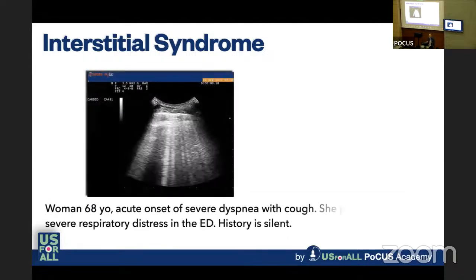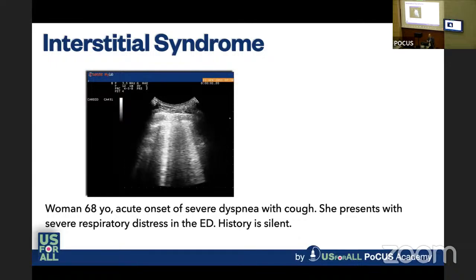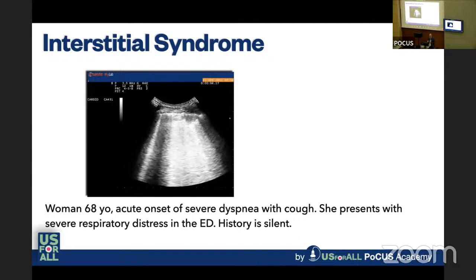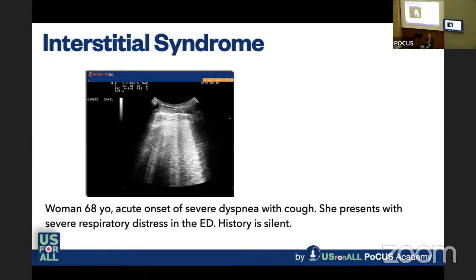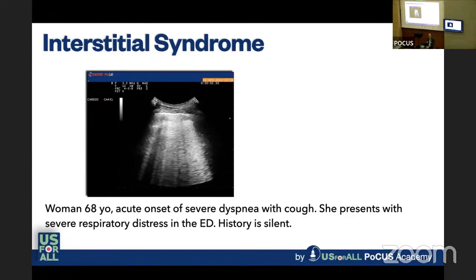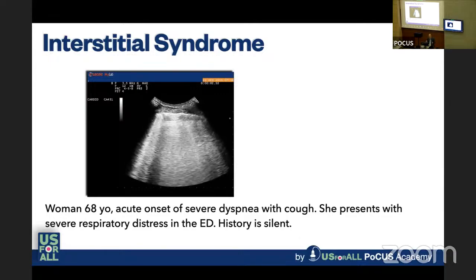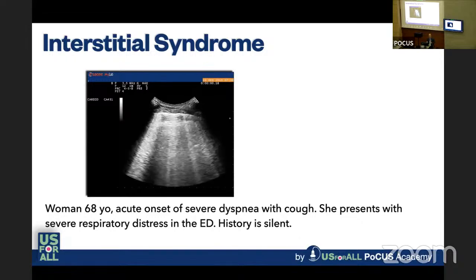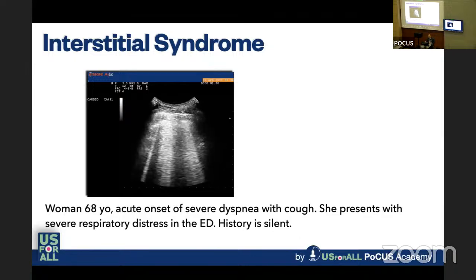For brevity, we only talk about the principles. In the afternoon, we will do hands-on together, and I will show you the technique, how to obtain the correct examination of the lung. Another important point for you to understand is that B-lines are the sign of a condition of the lung. That is, as I told you, partial loss of aeration. But they are not a sign of a specific disease, because we may have B-lines for many reasons, for many different diseases.